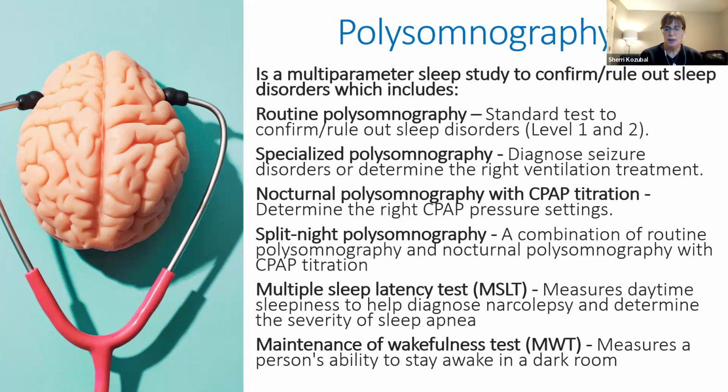And then, of course, multiple sleep latency testing or MSLT, which measures daytime sleepiness to help diagnose narcolepsy and determine the severity of sleep apnea. We'll usually do these the morning after someone has done a sleep study. So they come into the sleep lab for level 1, and then they would stay for the MSLT for the rest of that day, basically looking at how long it takes for them to fall asleep. It tells us the level of sleepiness, and if they meet the criteria for narcolepsy or just severe hypersomnolence due to sleep apnea or other sleep disorders.